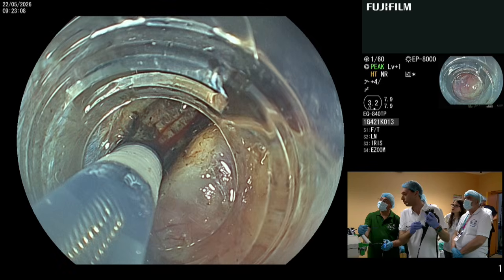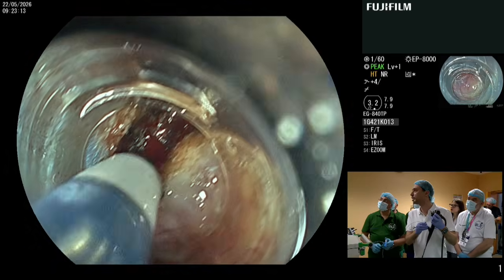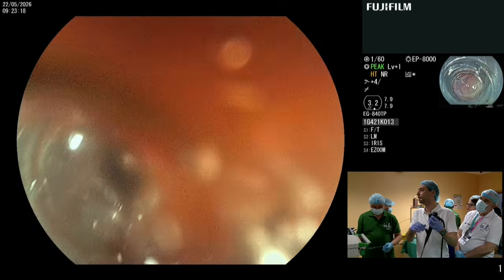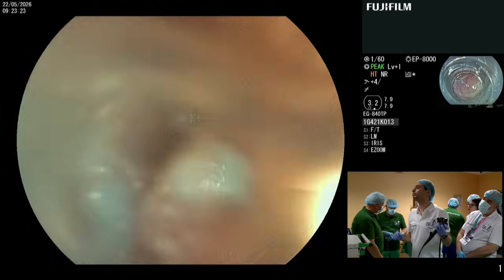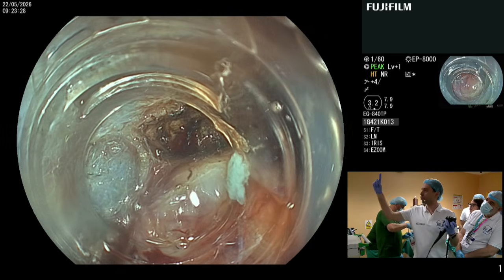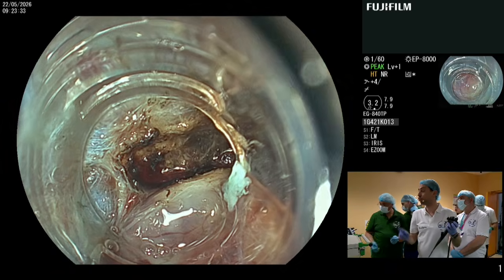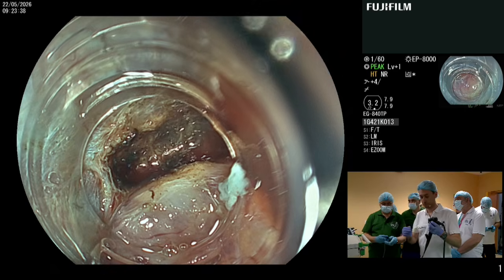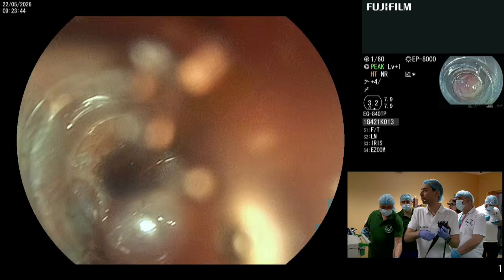Yes, so I will use spray coag. It doesn't work. If it still doesn't work, I will not insist. I will ask for a coag grasper. Please give me a coag grasper. The setting for the coag grasper is soft coagulation 4 or 5. Explain to us, please, where is the direction of mucosa in this moment? At this moment, the mucosa is up. So we have to be very careful not to provoke mucosal injury. It's very easy to damage the mucosa from thermal injury.